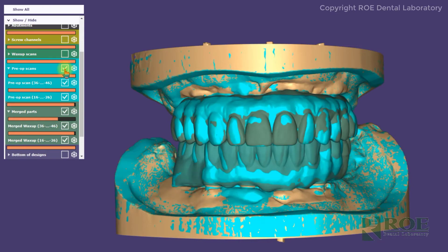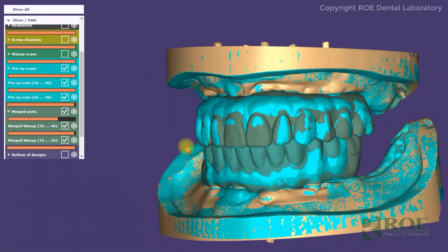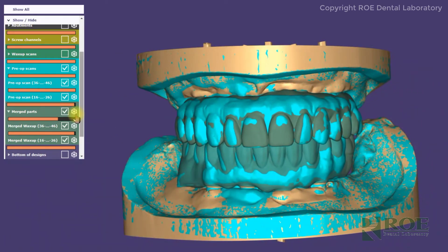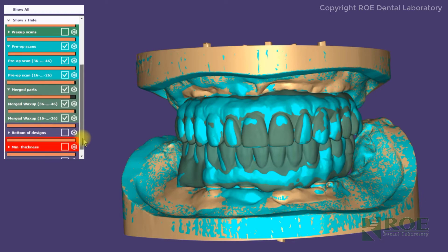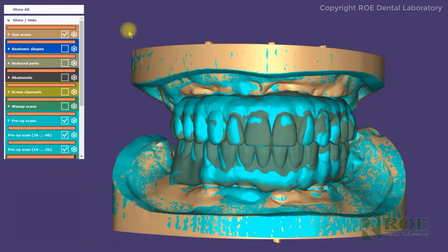So in this example, if you want to compare what the proposal is, or what the original was that came to our laboratory as compared to what we are making, you can toggle it on and off and make a comparison. Those are the multiple layers. There are other layers available, but these are the layers that we'll send out in a normal case view.